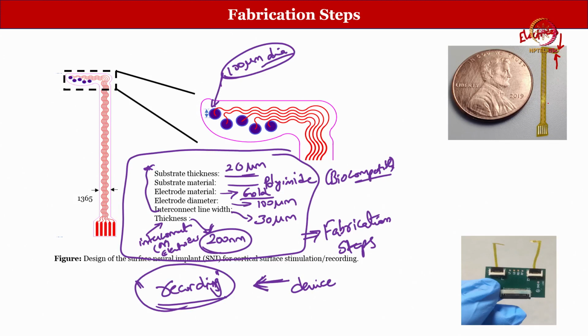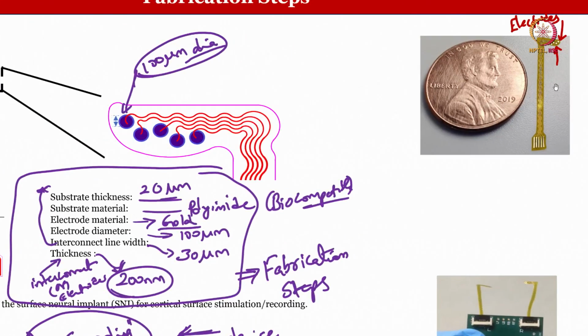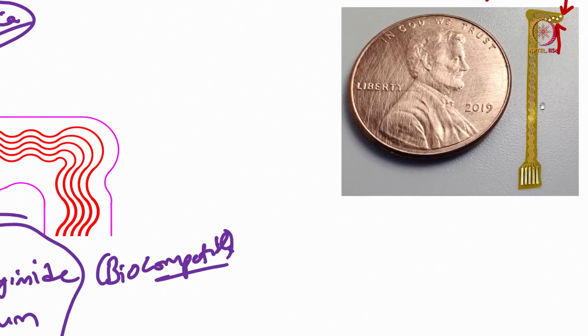If you zoom in a bit, you can see some serpentine shaped interconnects, and they are not shorted. They are separated by a distance of around 50 micron, and there are 5 shapes, and one can count them easily.